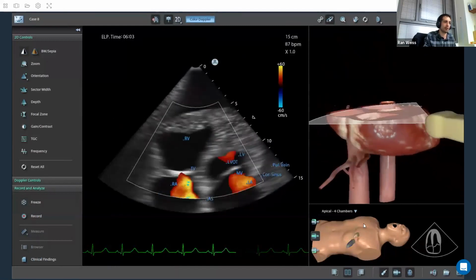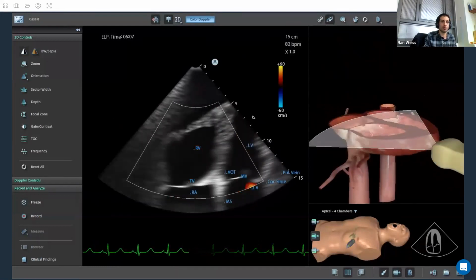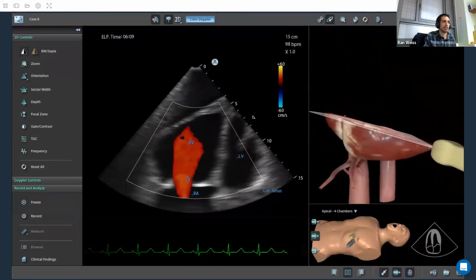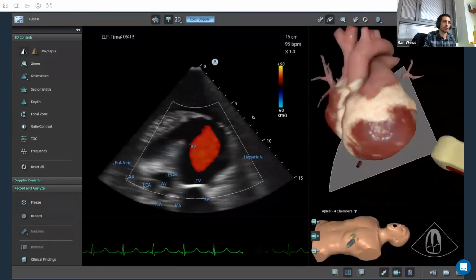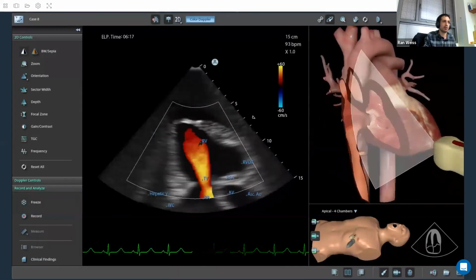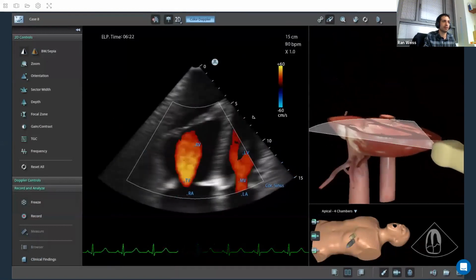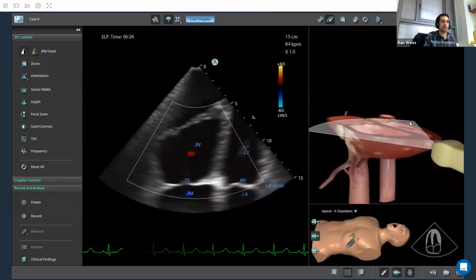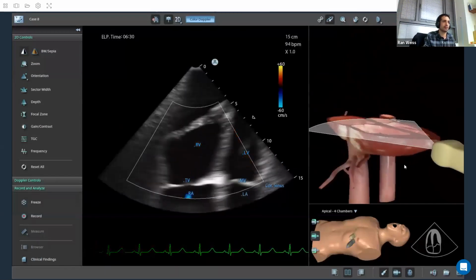You can see the probe traveling. I have another degree of freedom, which is the mouse wheel; you can rotate it similar to how you rotate the probe. Of course, it's something you need to learn a little bit at the beginning, but once you get it, it's very intuitive. The other degree of freedom, using the left click, is that I can also do tilting.